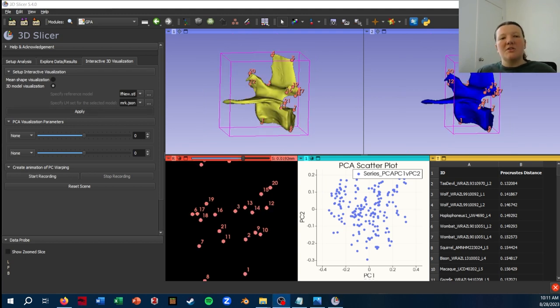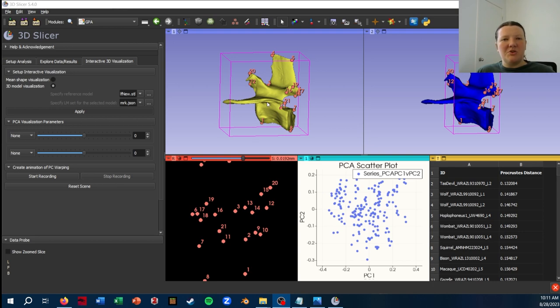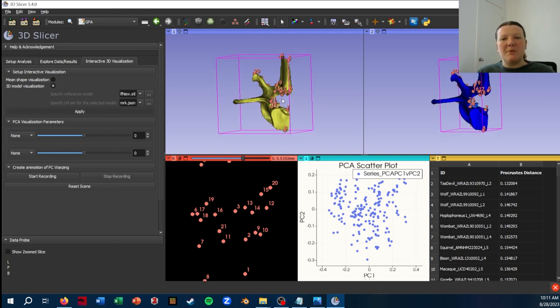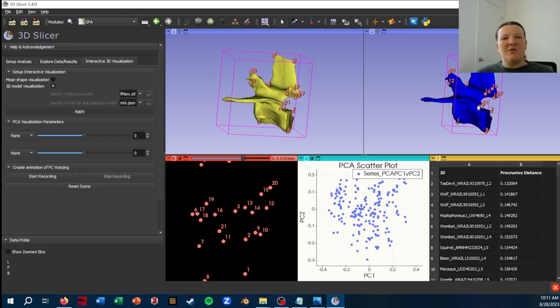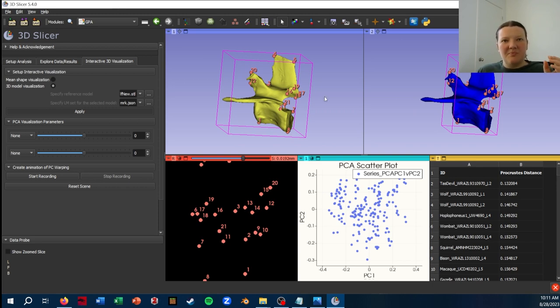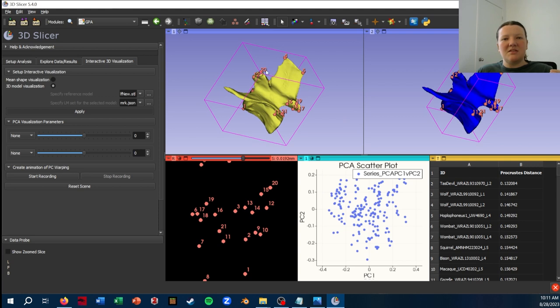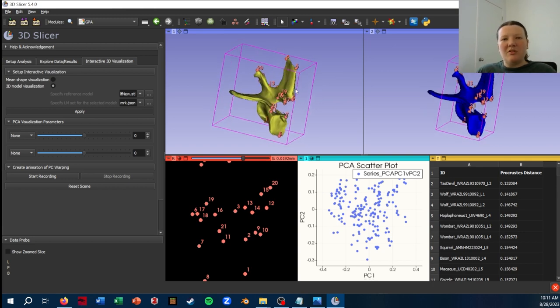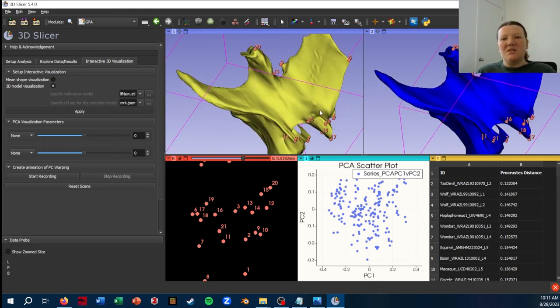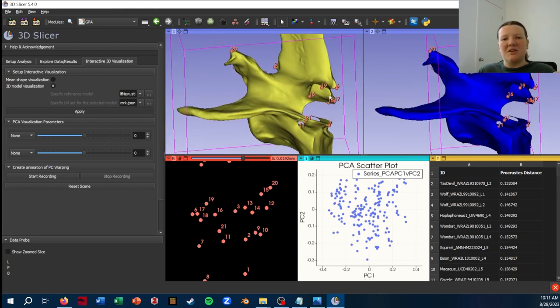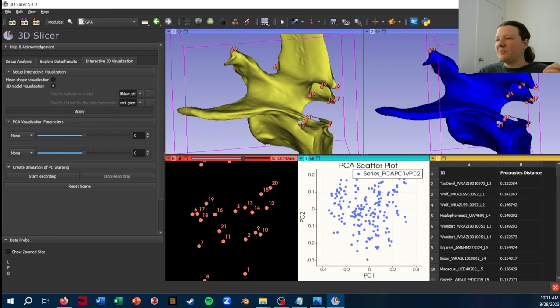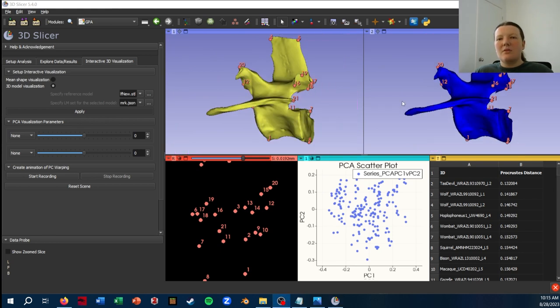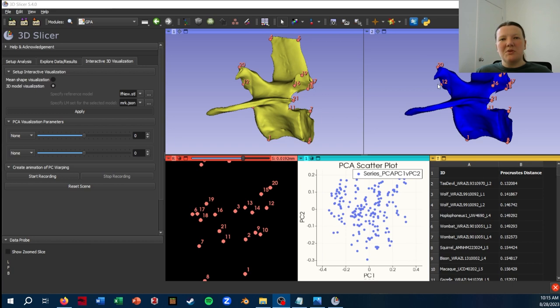Alright. So once you click Apply, you should see two models appear that look the same. One that is yellow, which represents the mean shape. And then one that is blue that you're going to be able to warp. So to be extra clear, this mean shape is not what the beaver vertebrae looks like. Normally it has been warped to fit the mean landmarks here.